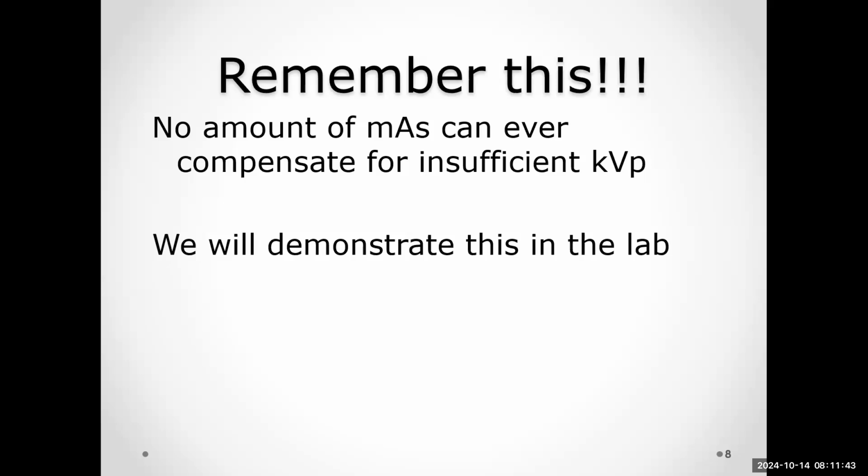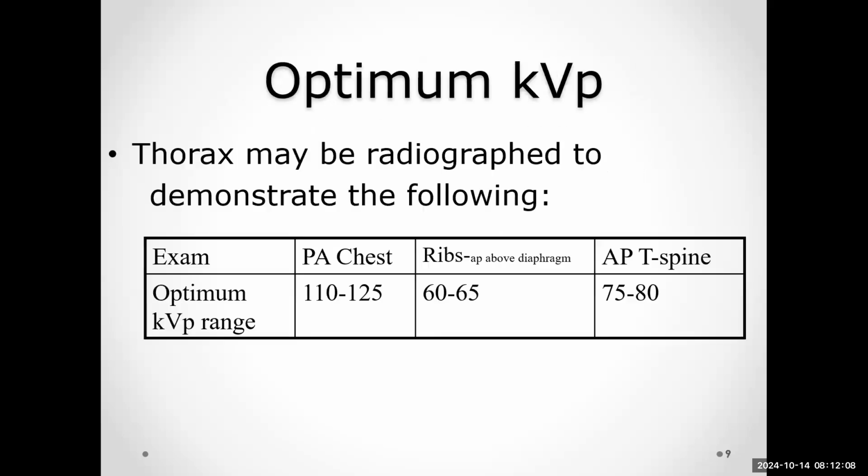So we're actually going to do this with the skull. I know y'all haven't had skull, but there's a really good area that we can see it through your mastoids, through those bones that sit right behind your ear. So there's a good area right there that hopefully we can demonstrate this. Even though the computer software is going to try its best to correct and make it look right. It's going to try to adjust the brightness level so that it looks right. But hopefully you'll be able to see that.